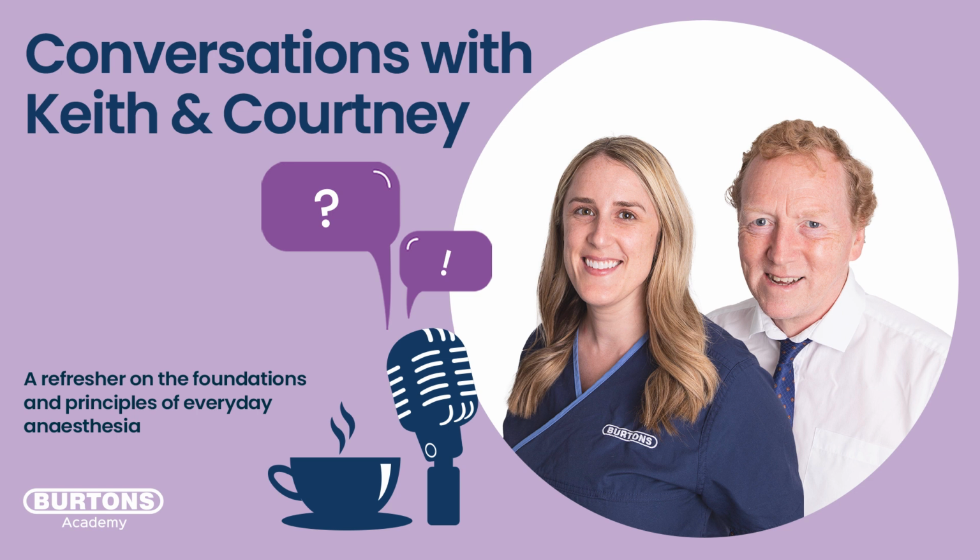Yeah. And I think that also brings in a discussion, just talking about circle systems, about oxygen concentrators and how to use them. Just like Keith mentioned before, they can concentrate pretty well, about 93, 97-ish%. What's actually happening with that oxygen concentrator is it's taking in the room air, and then we have a little zeolite-based sieve in there that absorbs the nitrogen in the atmosphere, and therefore it bulks up and concentrates the oxygen.